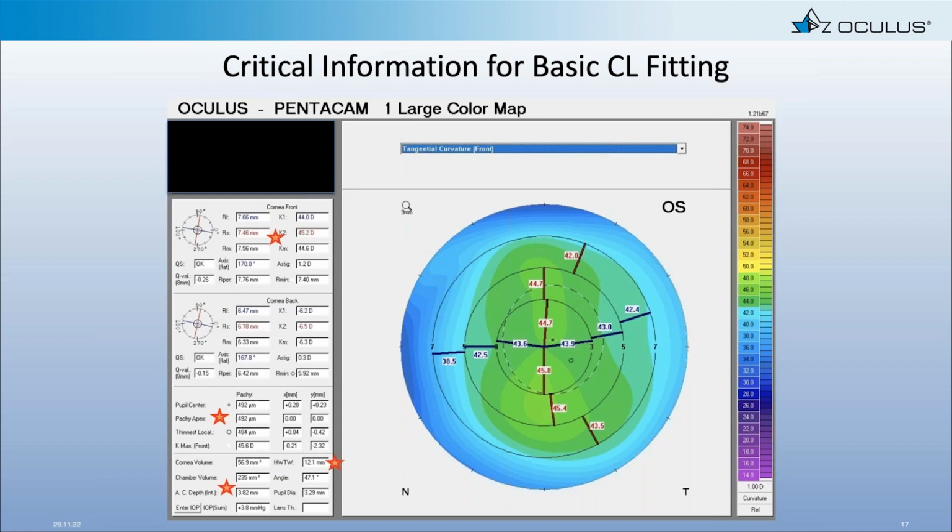So this patient probably would benefit from a lens with more depth to it than your average contact lens. And there are tables and charts out there to give us information about sagittal depth of soft lenses. So we would want to choose a lens for this patient which tended toward the deeper end of the contact lens options that we have. So it's important to have this information, so as we choose lenses, we pick a lens that will actually fit our patient properly.